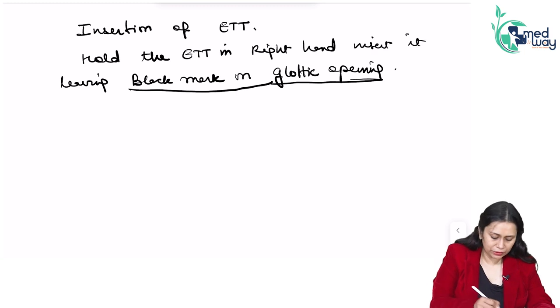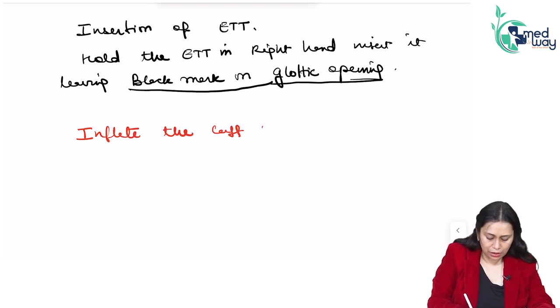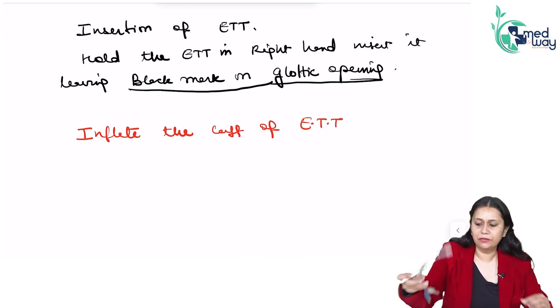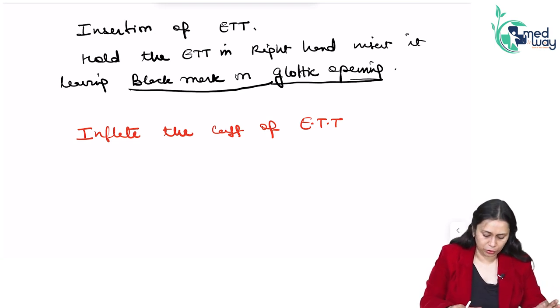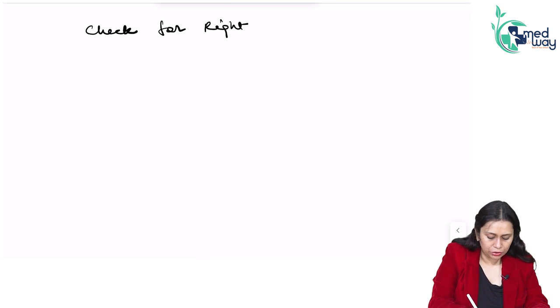After that, what do we do? Very important, we inflate the cuff of the ET tube. After inflating the cuff, what do we do next? We have to check for the right position of the tube.